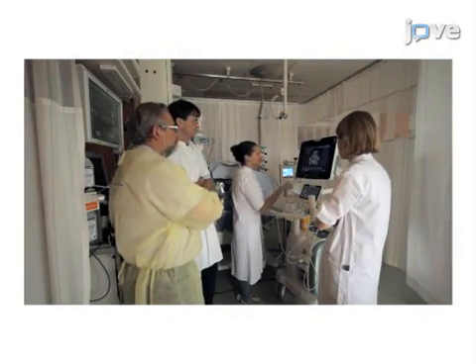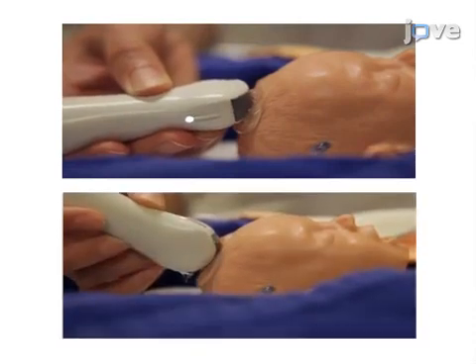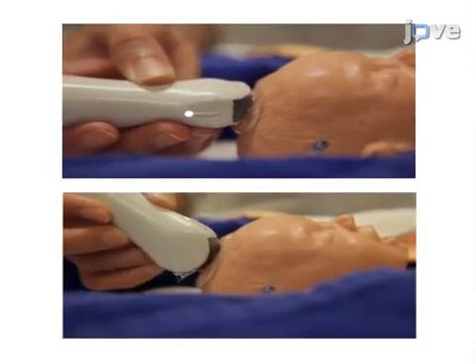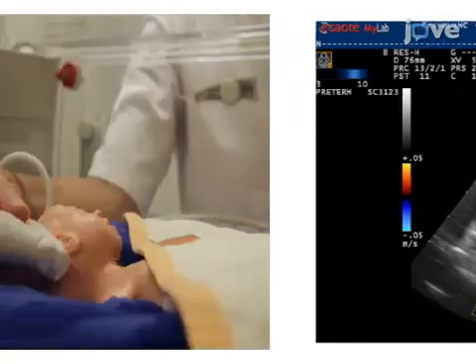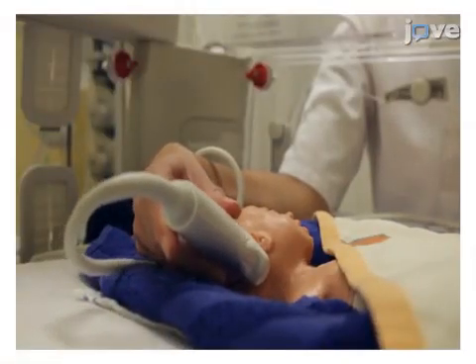After calibration of the imager, a series of at least five coronal and sagittal plane images are acquired through the anterior fontanelle. Color Doppler is used to visualize intracranial vessels, and use of supplemental acoustic windows improves detection of brain injury.